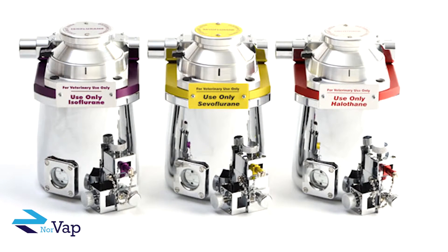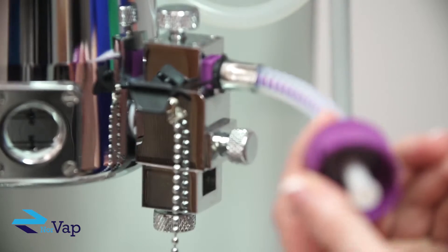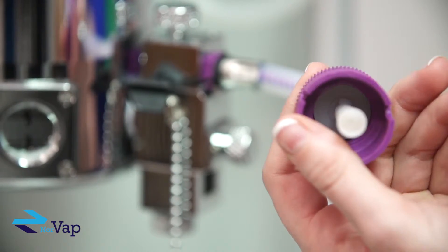It's worth noting that each vaporizer here at Norvap is individually calibrated to ensure the accuracy of flow output. And remember, our vaporizers are all color coded according to their drug type, helping users easily and safely identify them.